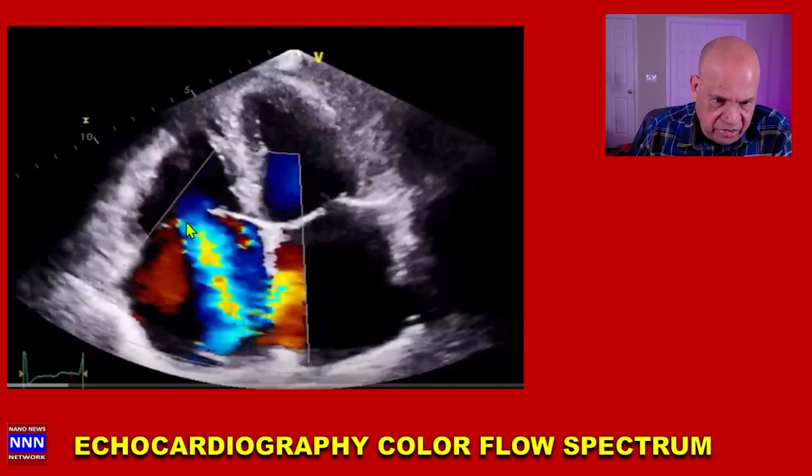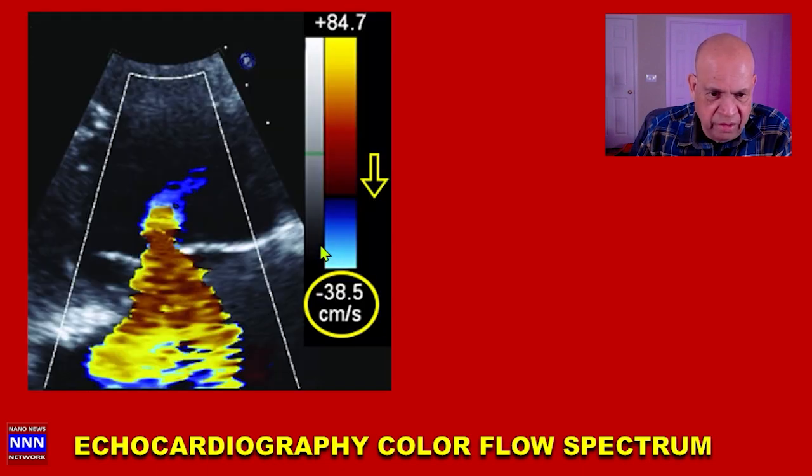And here's another example where there's a wide neck here, and we have a turbulent flow which is covering almost 1/3 of the right atrium. And there may also be an interatrial septal defect because we see some wave disturbances going across the atrial septum. So there's a lot of information that can be deduced from the underlying 2D echocardiography, which gives us the structural anatomy, and combined with this color flow Doppler, we can deduce a lot of factors which are not possible by any other means of diagnostic test.